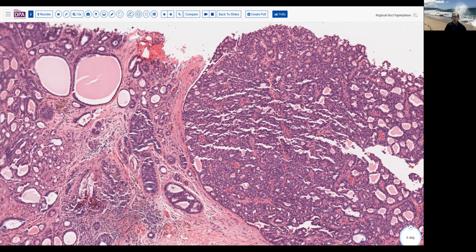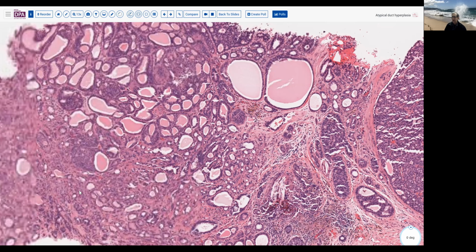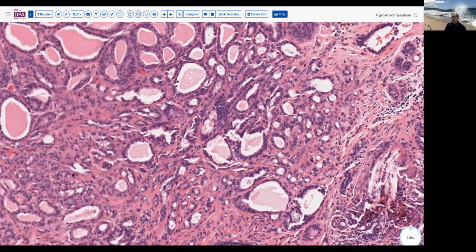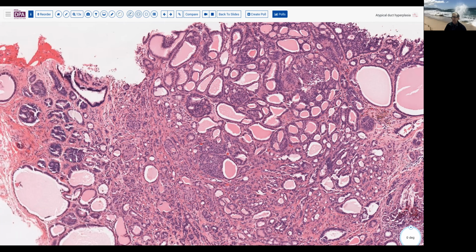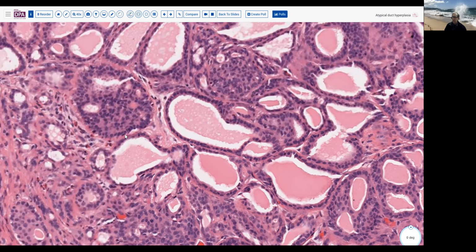And then over here, we have the pattern of sclerosing adenosis with lots of small ductal type spaces, or small spaces with variable cystic structures. And this is mixed with a somewhat fibrotic, sclerotic background. This is a benign change, but sometimes these kinds of structures can be involved by a more confluent proliferation like this we're seeing here, which begins to look like ductal carcinoma in situ.